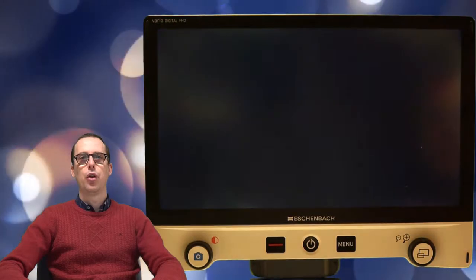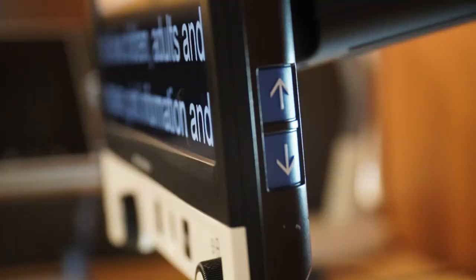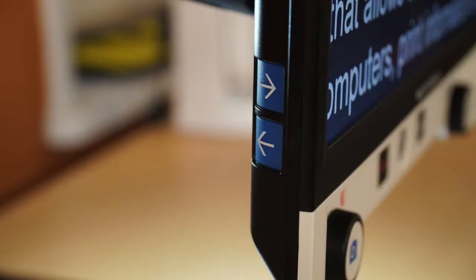This is where things get a little bit complicated. One of the features of the Vario FHD is panning. So you can do a live panning of the image rather than moving your paper underneath the camera. You can press buttons to pan left and right and up and down. And those are located on the sides of the device. But you can't do panning just in your regular magnification mode. You have to choose one of these special reading modes for some reason.